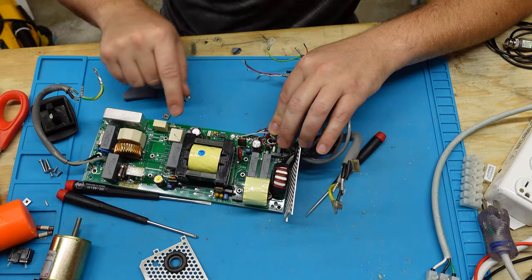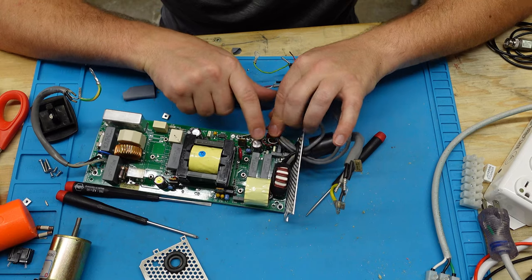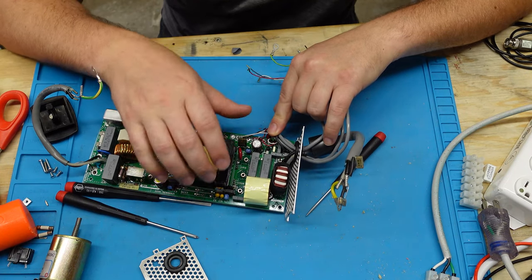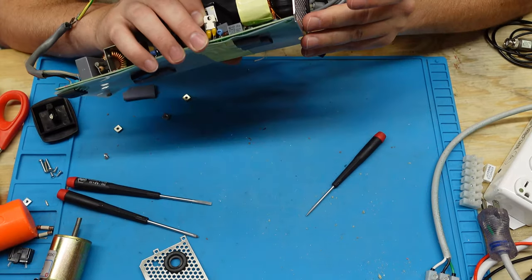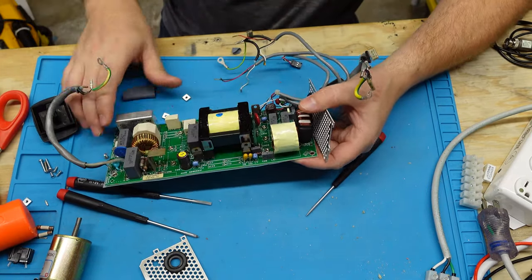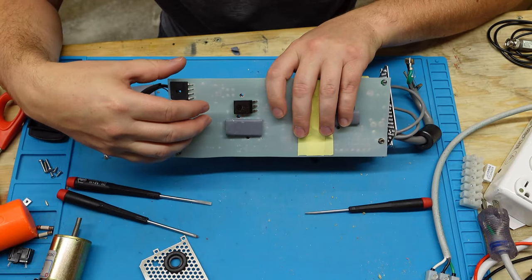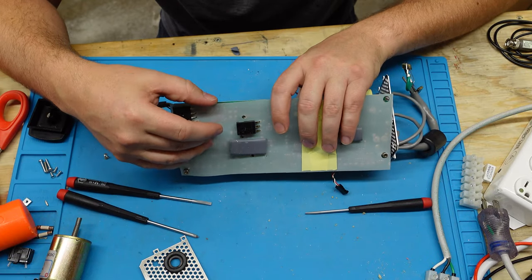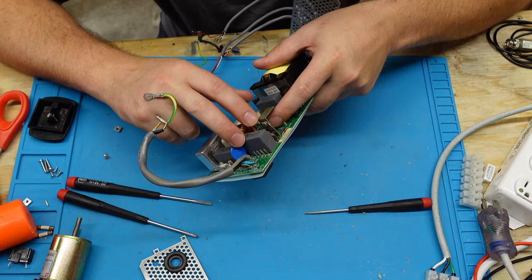The capacitors look like they're solid. Often, especially over here on the output side, you'll see these capacitors get very bubbly, and they'll leak. It's looking pretty good. Transformers all smell fantastic, like regular electrical components. I know you guys probably think it's weird that you smell a board, but believe it or not, smelling a board will really help you find other problems.